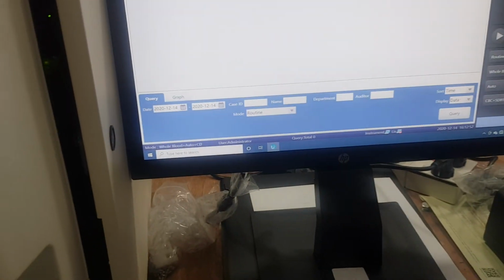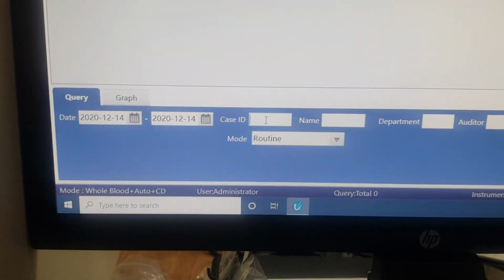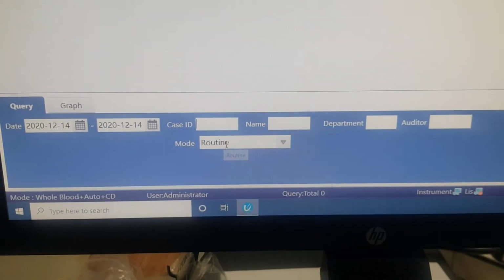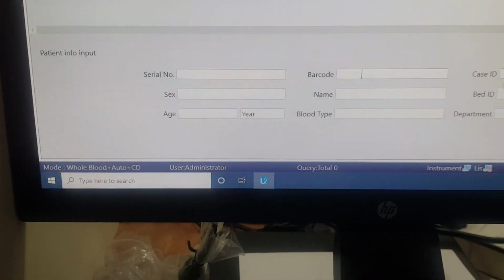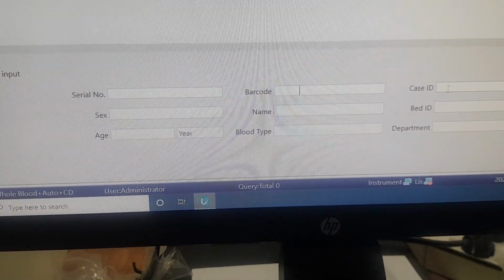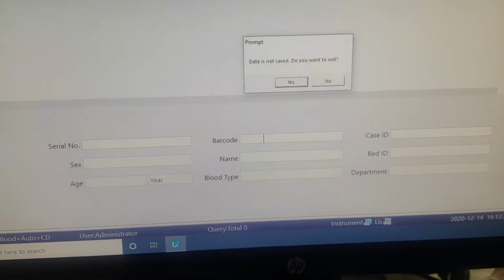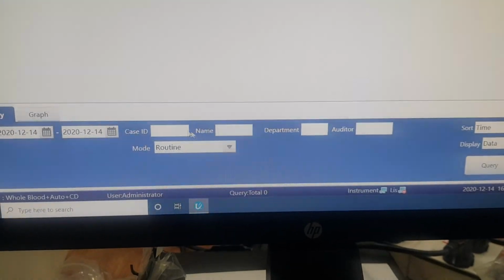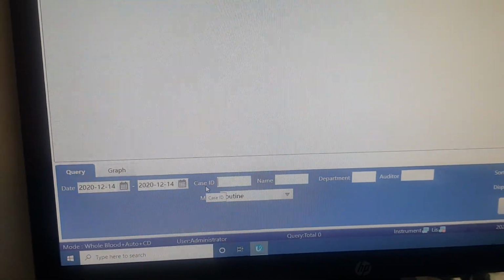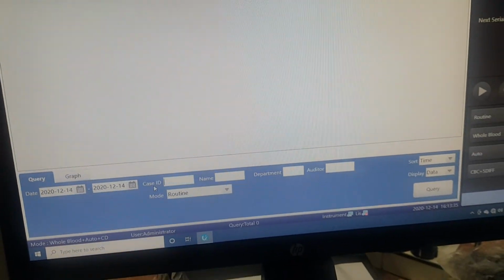Also, when we want to search the result, see, here is case ID. Here should be barcode ID, not the case ID, because when we make the work list in new work list, we did not put case ID. So the customer will not put case ID. If there is no case ID, how can we search with the case ID? Because we are searching the result as per the barcode ID, the patient ID, not with the case ID. I hope you get all the point.